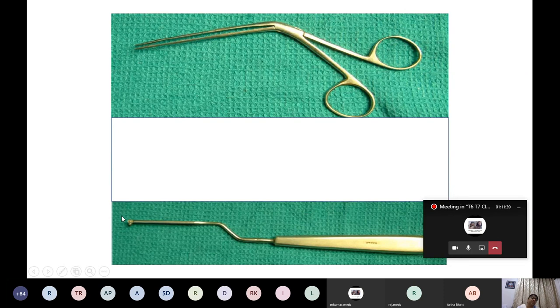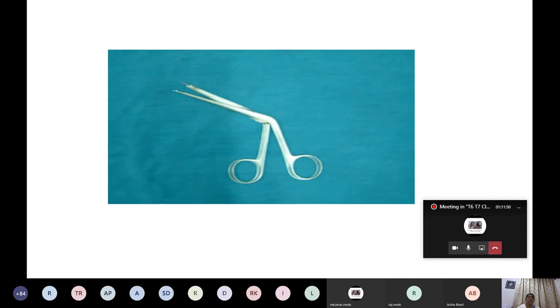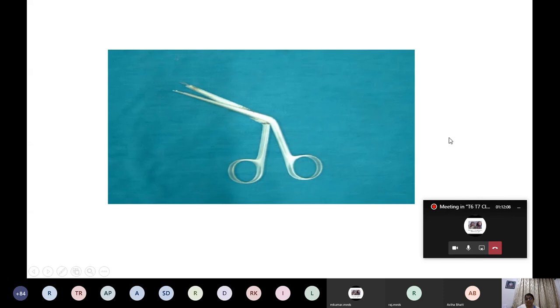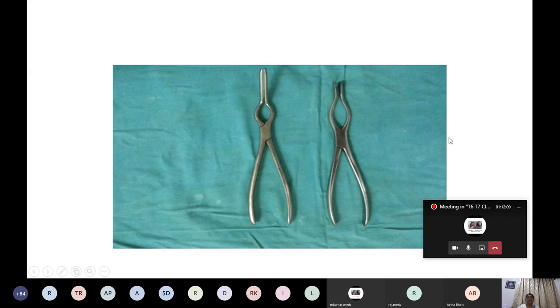The Ballinger swivel knife has a blade that moves 360 degrees and is used in submucous resection of the septum. Hartmann's nasal speculum has heart-shaped or triangular blades. The nasal packing forceps leaves a gap between blades and can also be used for foreign body removal.